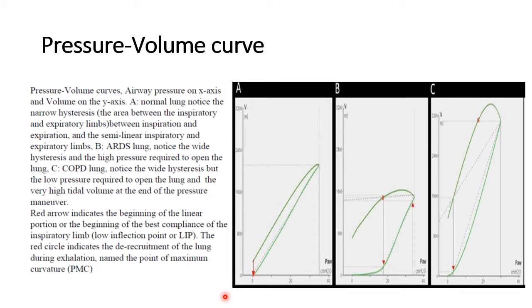And to get this curve accurate, a quasi-static curve, you have to have a passive patient with no effort, which gives you more information about the compliance of the respiratory system. It has to be done with a very, very slow flow, so the effect of resistance becomes minimal, and it has to be done using the constant square flow waveform.